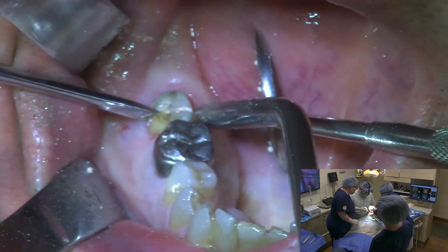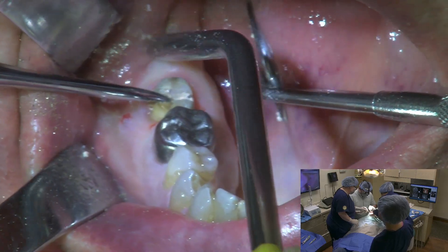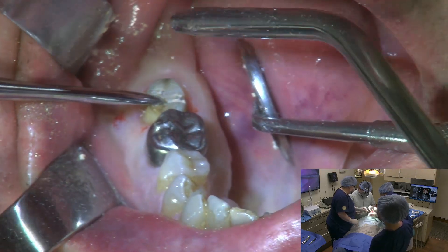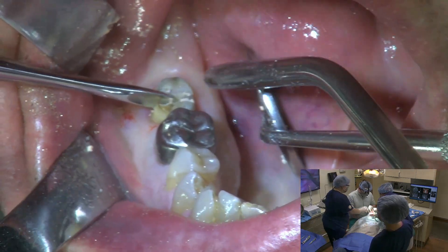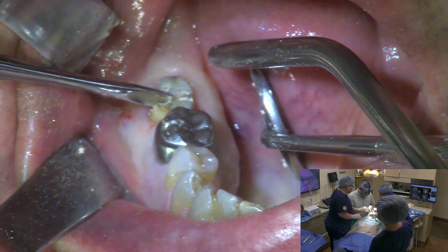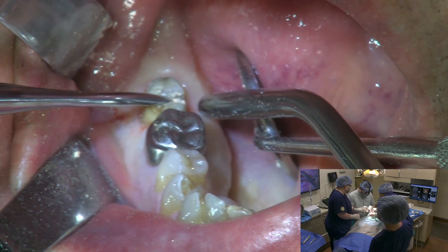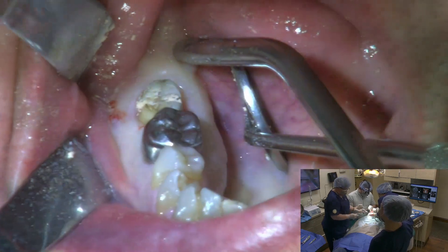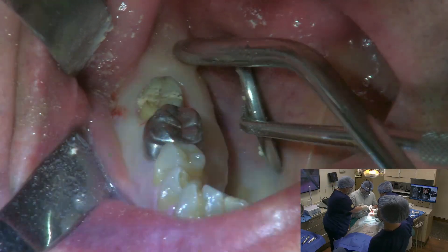A bit of pressure — this tooth is probably already fractured, so you'll hear a little bit of noise. But if you feel anything other than pressure, you've got to let me know. Just moan at me or wiggle your hands or whatever.